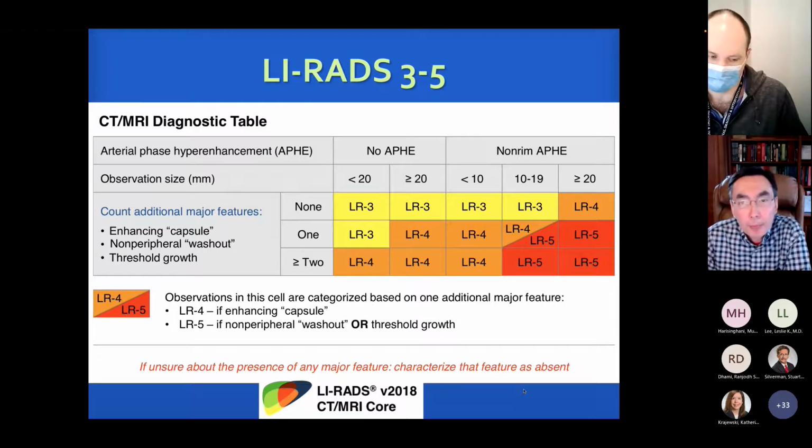and not specific to HCC. And the second major feature is the size of the observation. So is it less than 10 millimeters? Is it 10 to 19 millimeters? Or is it at least 2 centimeters or larger?